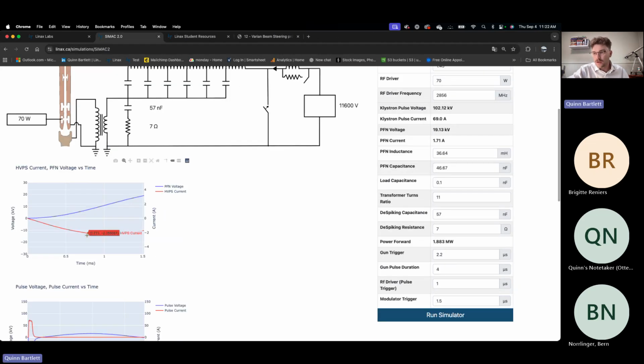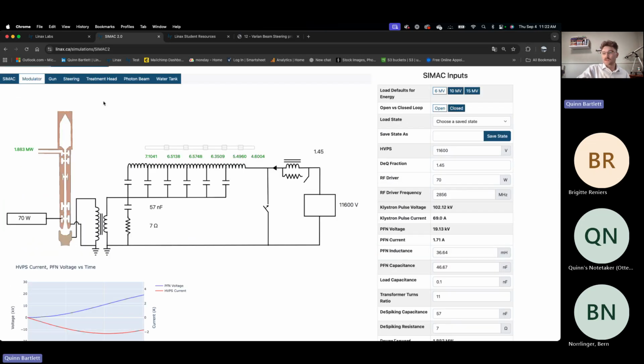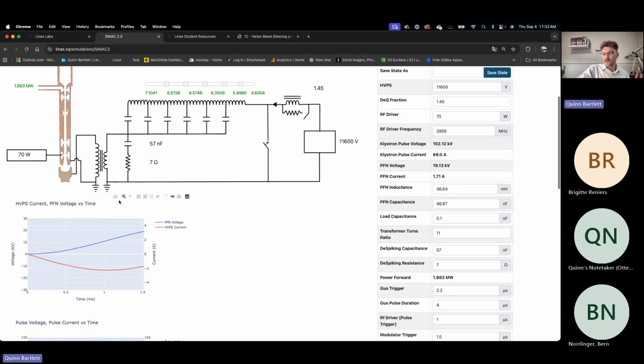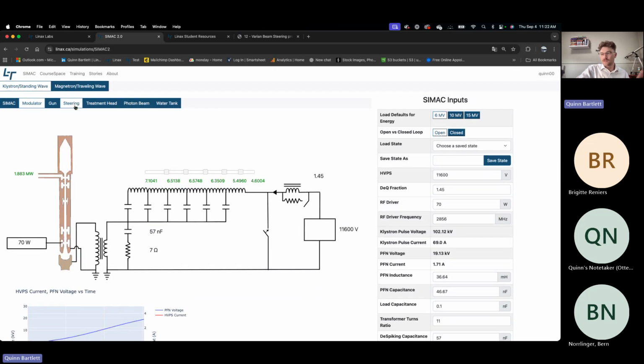I thought we could export these ones. Sorry, guys, I should have been on this. But I will say that I'll work on figuring out how to get the CSV out of these ones, because we should have them in all of them. So this is a great question.